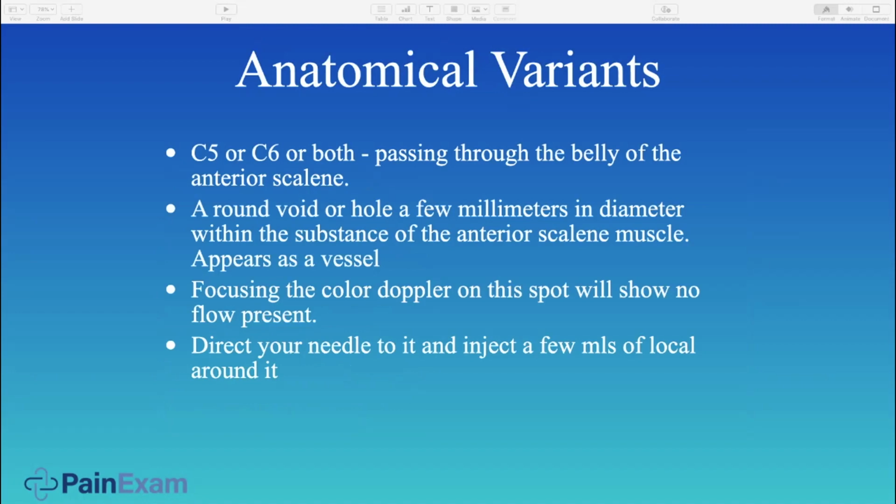When you want to inject it, just make sure your needle is not in the nerve, of course, but right around it. So you need to be very good with your ultrasound needling skills. And there are a few tricks to help you with this. One is practicing on a phantom. The other is learning to be ambidextrous when you train, as well as keeping maybe one finger on the probe or your other hand while you're needling so that you can actually move everything as one unit.